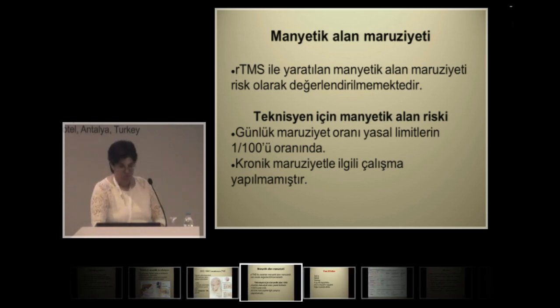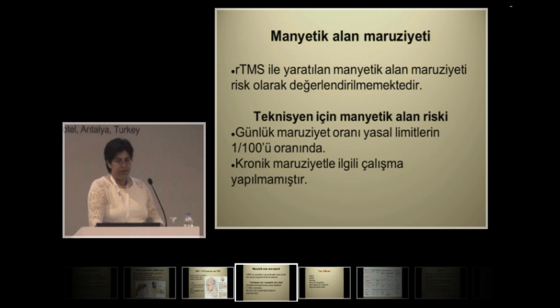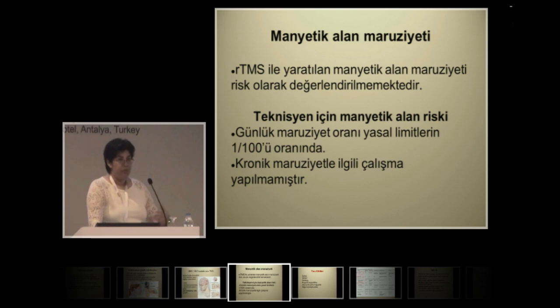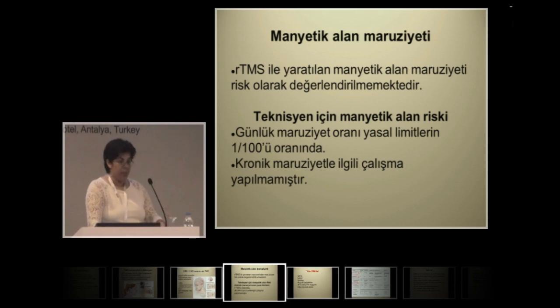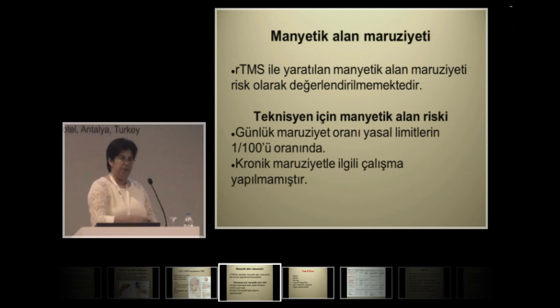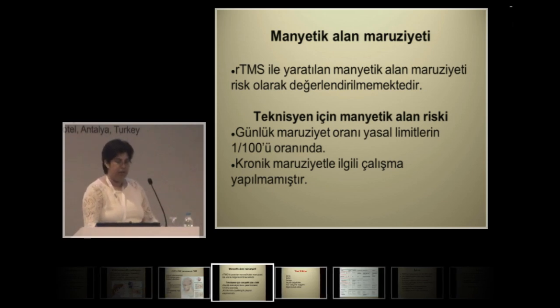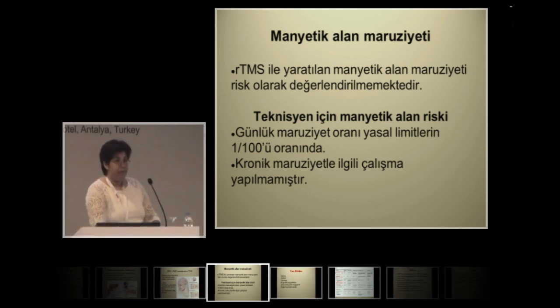Exposure to the magnetic field is something that is really a concern for patients. What will happen if it's used on pregnant women? The magnetic field that is created by TMS is not a medical risk. What really is a question, if you use it successively, is that it could be a risk for the technician, because they are exposed to this magnetic field much more than the patients. If you perform a TMS session, the magnetic field exposure is 1% of the legal limit.